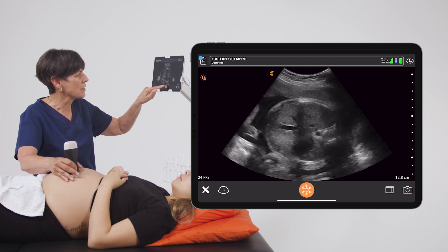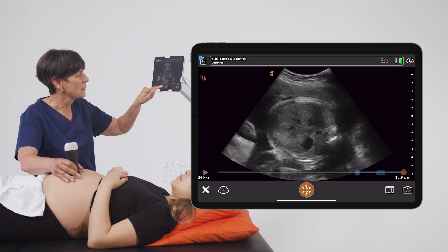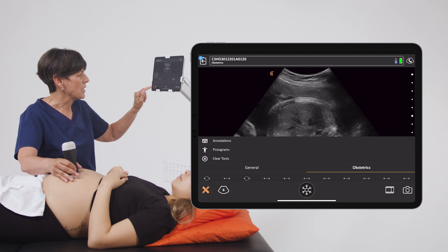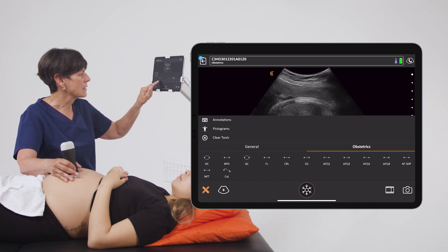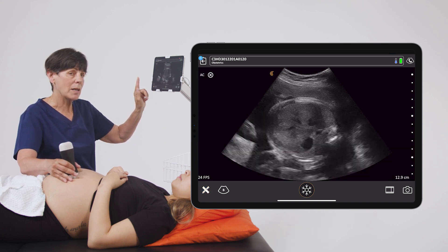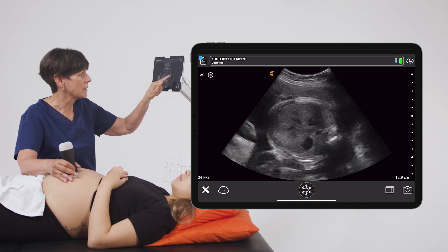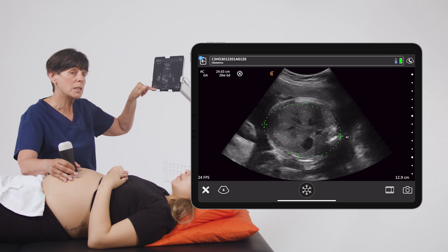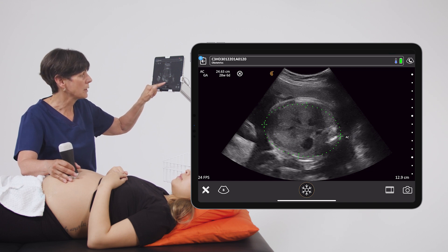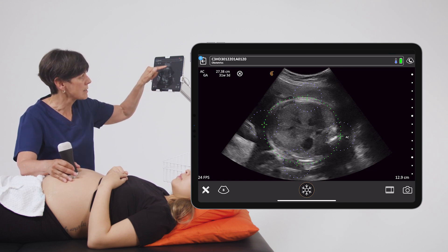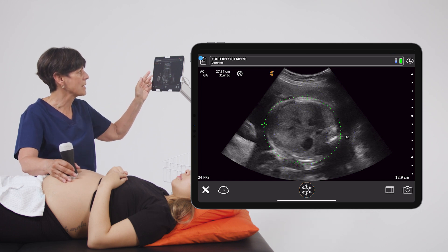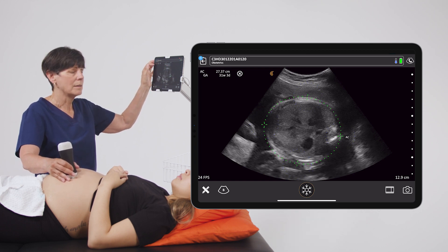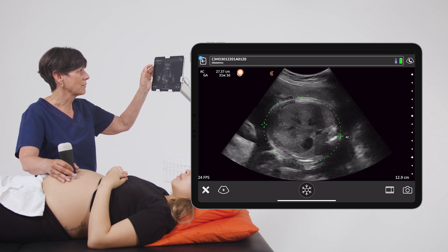Once we have all of those structures on the screen, I'm going to enter into the measurements and select abdominal circumference. I like to start at the spine for my first cursor and then go across to the front of the abdomen. This will initiate an ellipse where you can finally adjust until you get a nice circumference of the baby's abdomen, and the value will be displayed in the upper left.